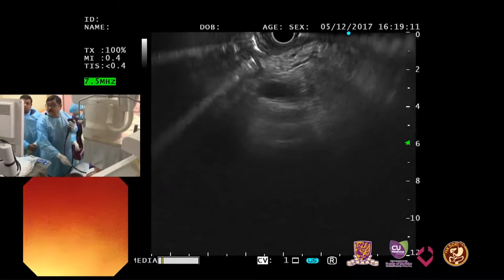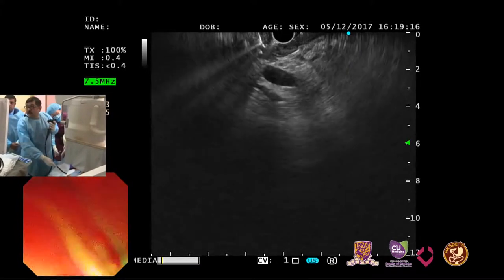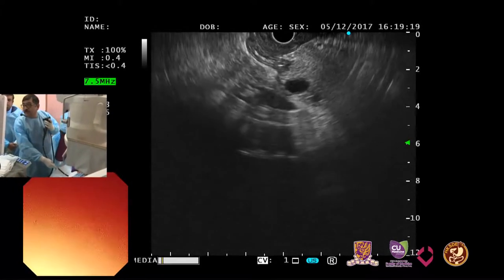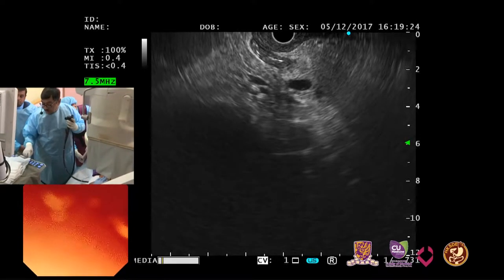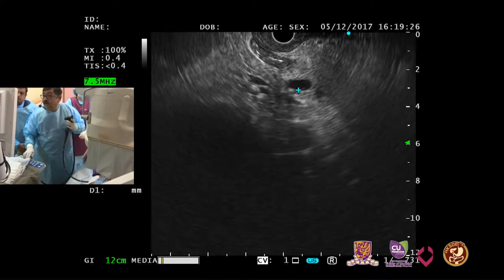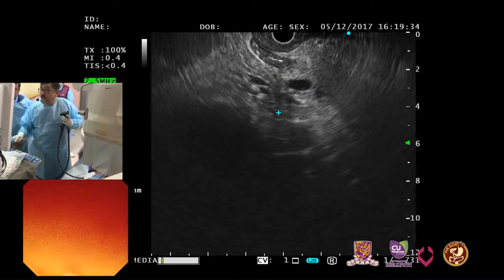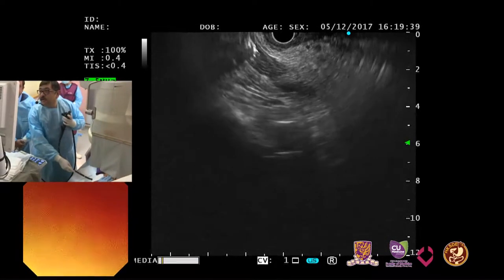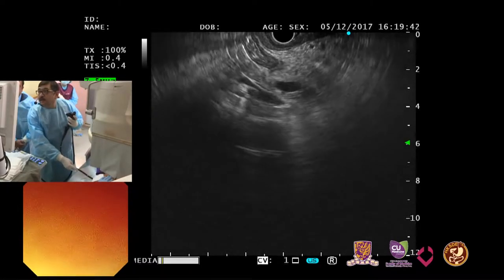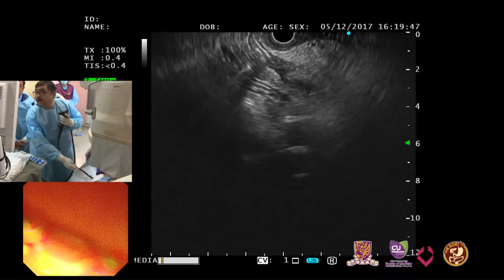So we are in the duodenum now. You see the bile duct turning clockwise, now you see the PD, freeze. So here you see the bile duct, this is the common bile duct, this is the pancreatic duct, both of them are converging together and this is the duodenum. So let's trace it towards the end and see. Here they join at the papilla.